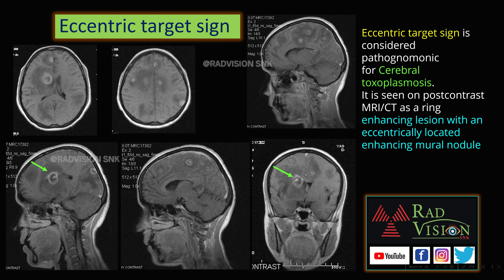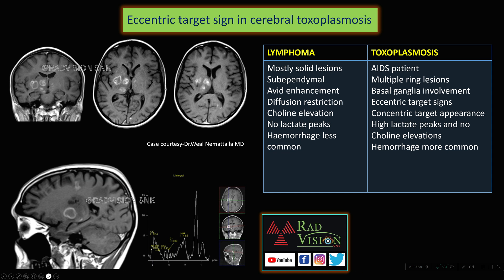Next: what is the eccentric target sign? Here you can see there is an enhancing lesion with an eccentrically located enhancing mural nodule. This eccentric target sign is also seen in cerebral toxoplasmosis, and there will be lactate peaks in toxoplasmosis. The close common differential is lymphoma.